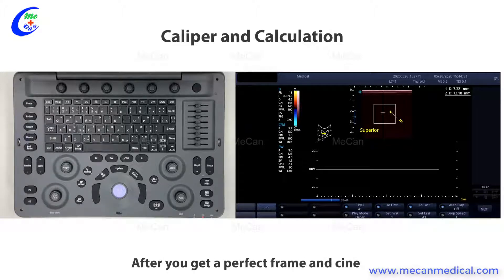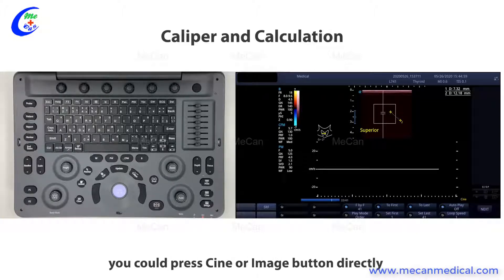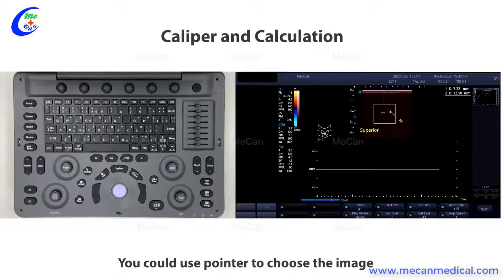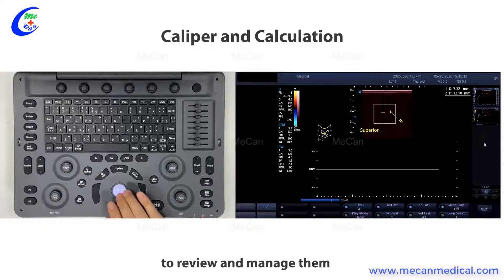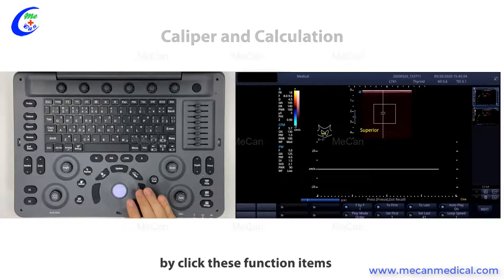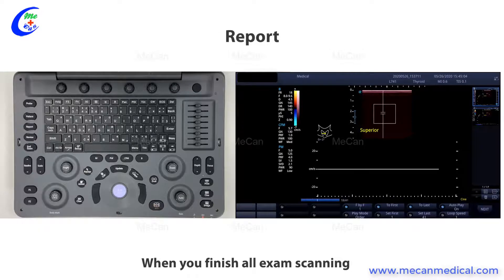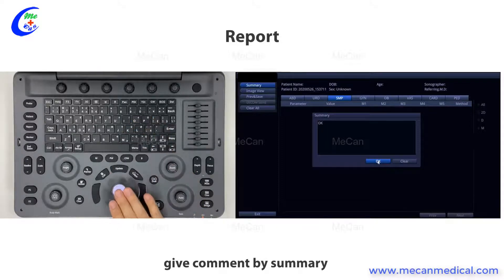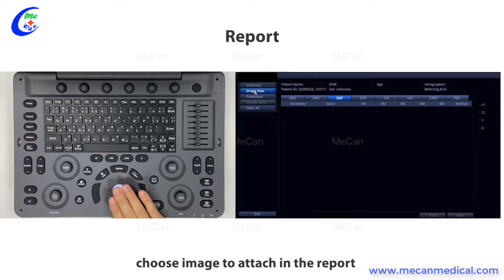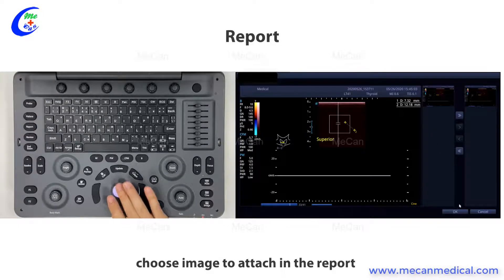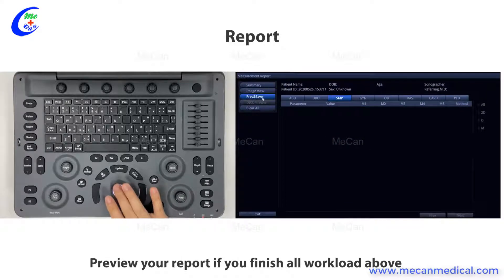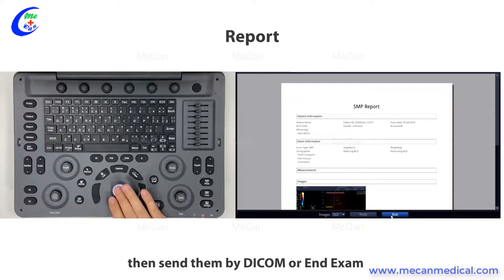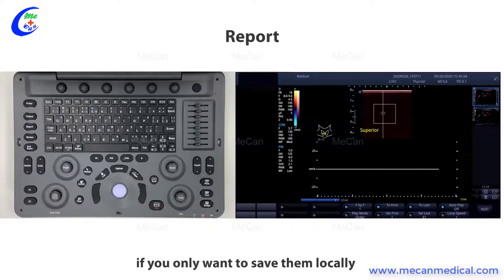After you get a perfect frame and cine, or finish all the annotation, body mark, and calculation work, press the cine or image button directly. The image and cine will be saved. You can use the pointer to choose images to review and manage them. When you finish all exam scanning, press Report to view the calculation results. Add comments via the summary field, choose images to attach to the report, preview your report, then send via DICOM or end the exam if you only want to save locally.